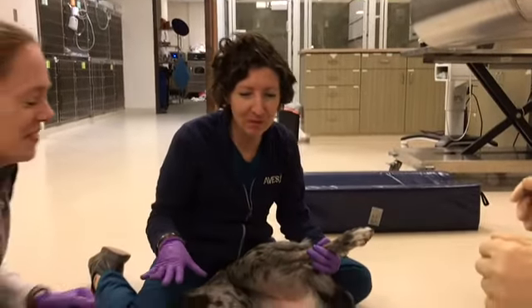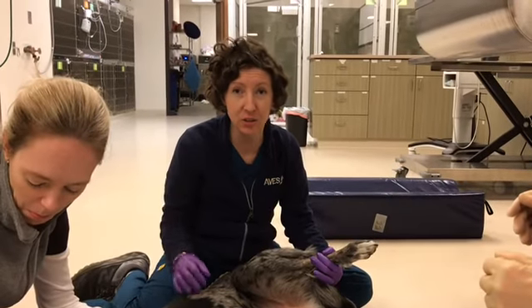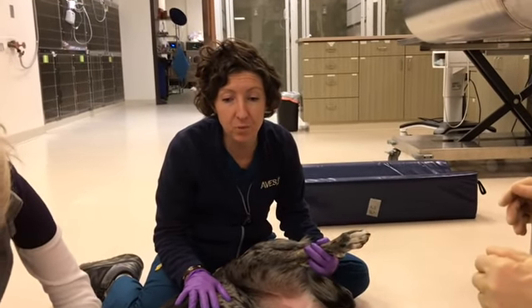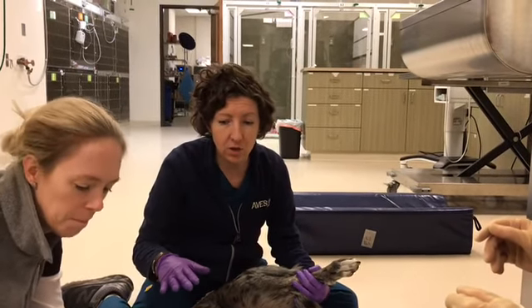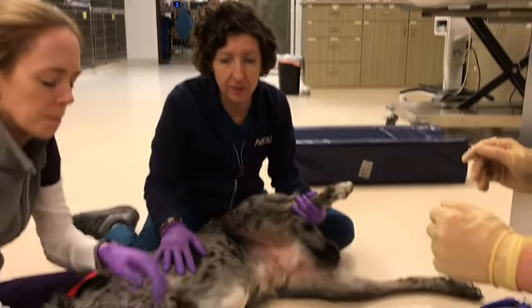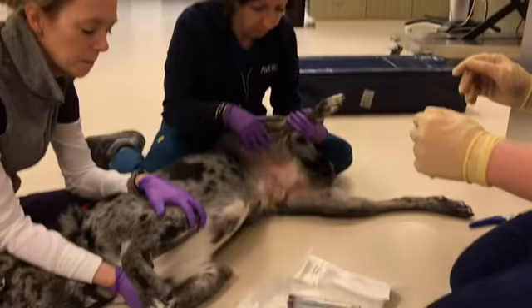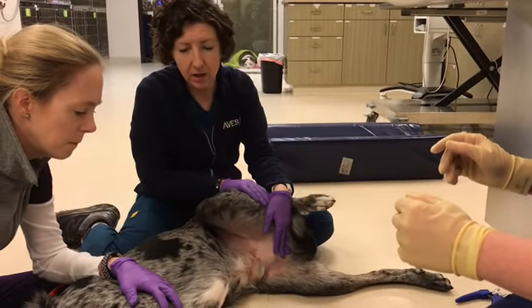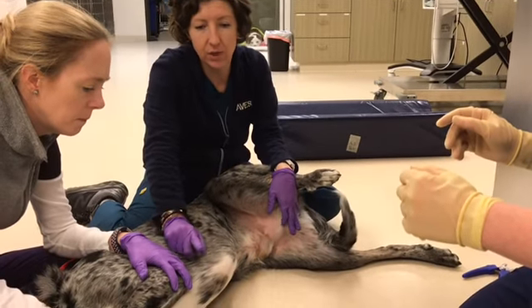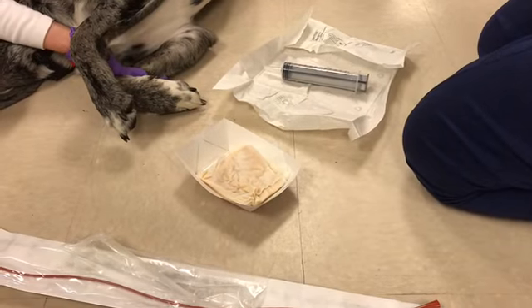Okay, so today we're going to get a sterile urine sample with male intermittent catheterization. We have them in lateral recumbency. I am going to extrude the penis and we're going to clean it with iodine.